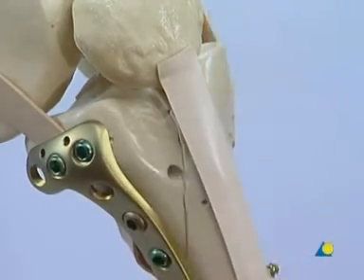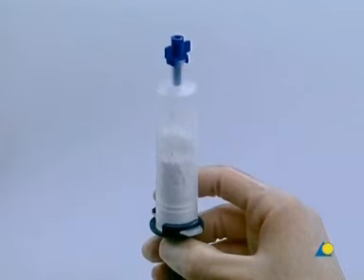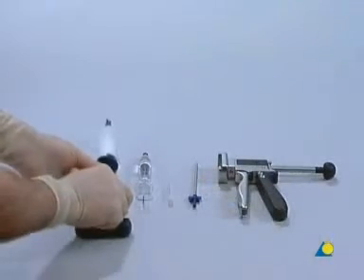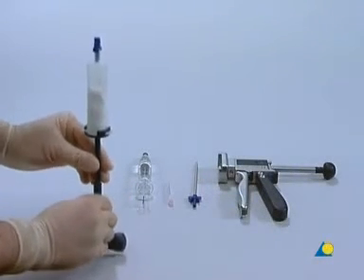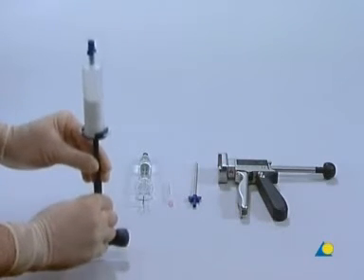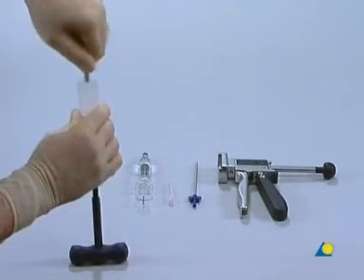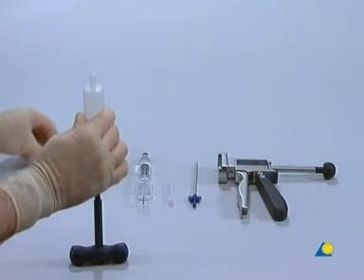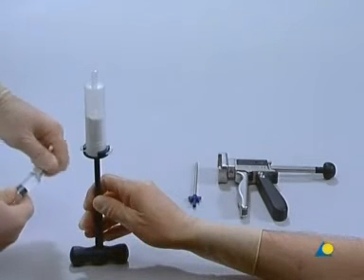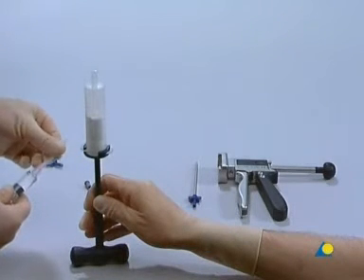Injection of a bone substitute — Kronos inject. The Kronos inject powder is supplied in an application cartridge. Tapping the application cartridge is necessary to make the powder fall into the base of the cartridge. The blue sealing cap is removed, and the blunt injection needle is mounted on the syringe containing the liquid component.